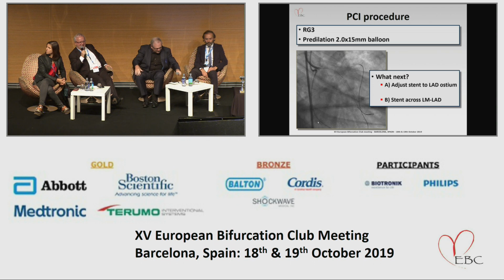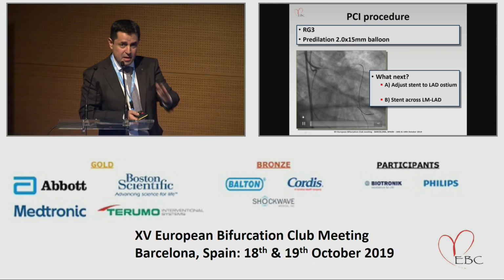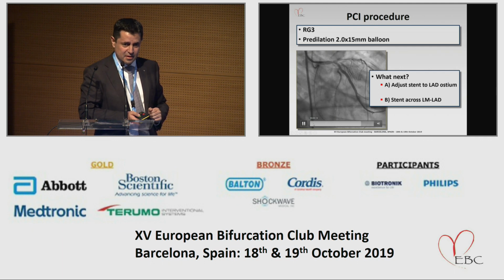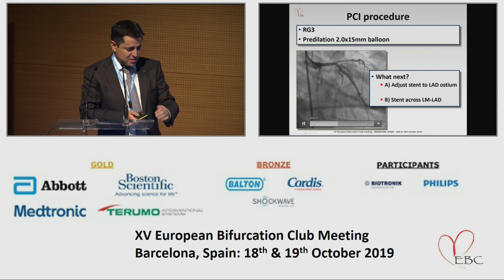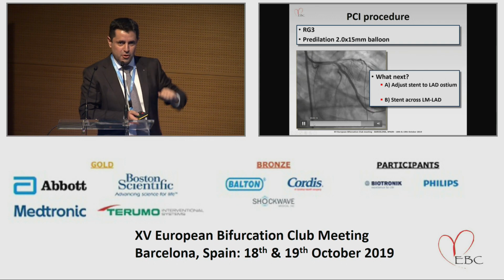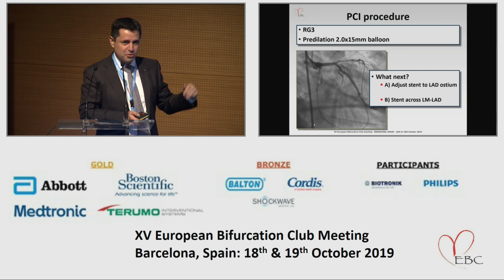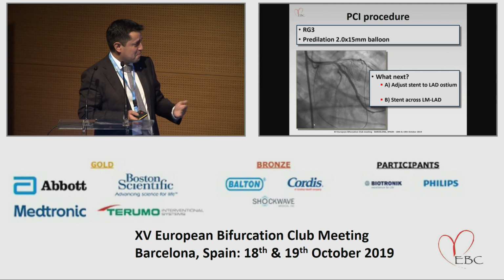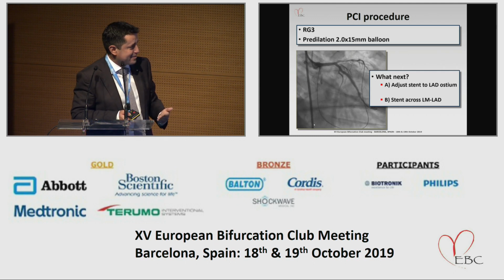So now we saw finally the angio. May I poll the audience? How many of you would try to adjust the stent to the LAD, and how many of you would stent across the left main LAD? Please raise your hand. And how many would stent across the left main? Okay. So the operators decided to do A.